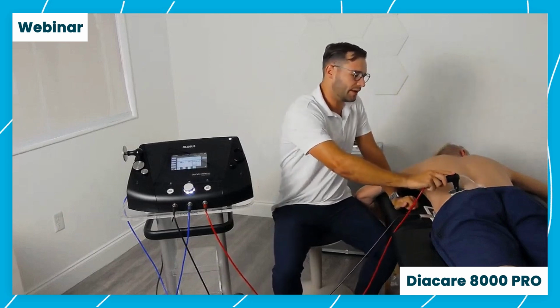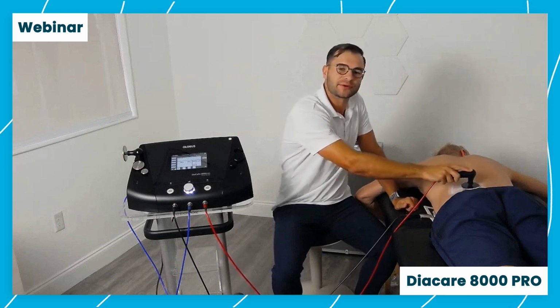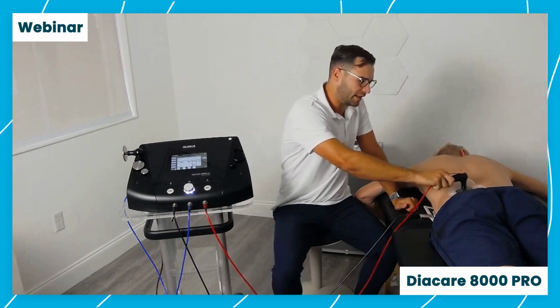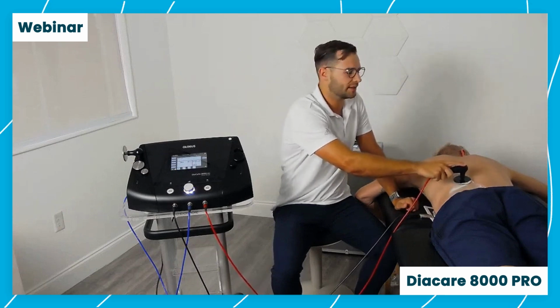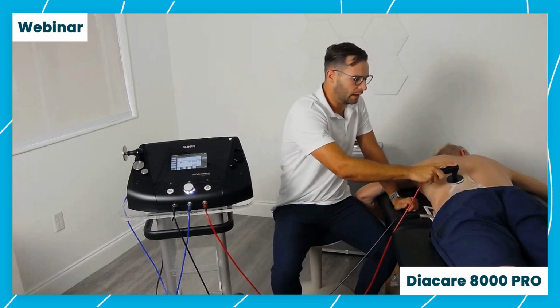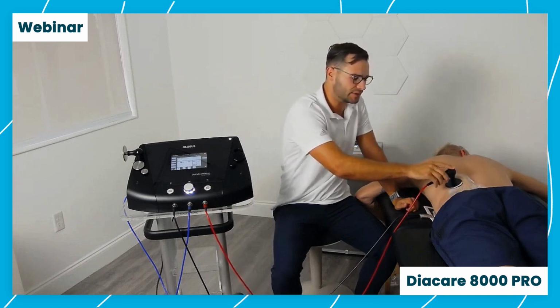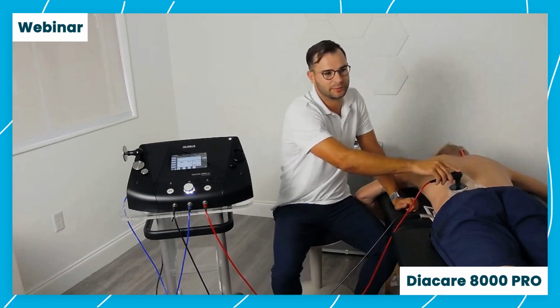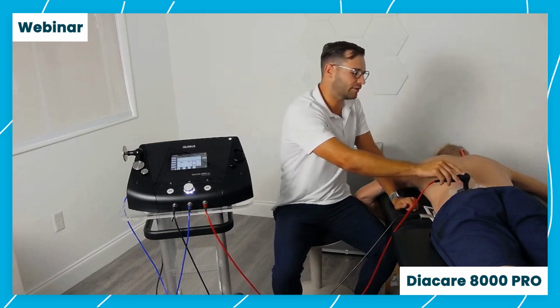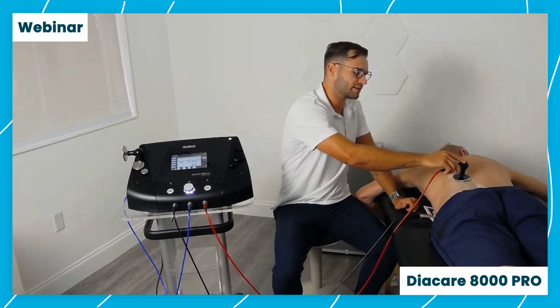There are many different programs that we can use using the Diacare. There are over 360 pre-programmed protocols already built in. That seems like a lot. However, like I said, a lot of providers like to use their own protocols. They like to build their own treatment sessions. So we have the ability here to put users into the Diacare. So we can put 999 users into the Diacare, and from there, each user can create 999 of their own protocols, almost an infinite number of different protocols and uses of this machine throughout the body and whatever you're trying to target that tissue.